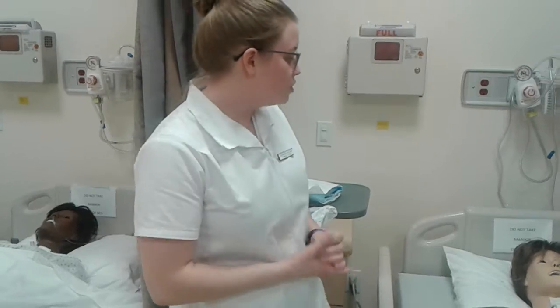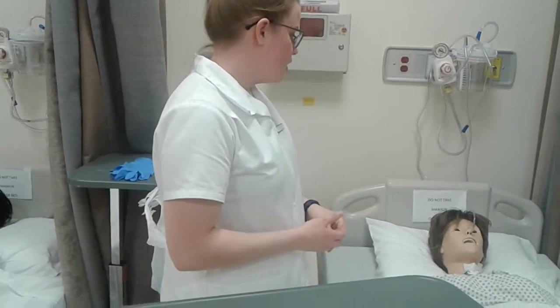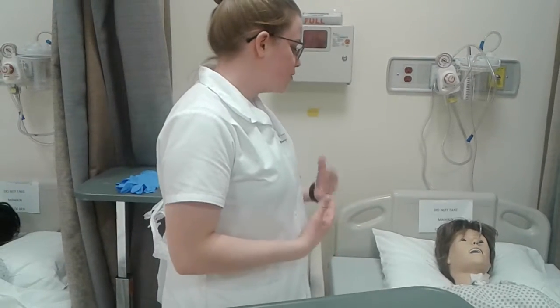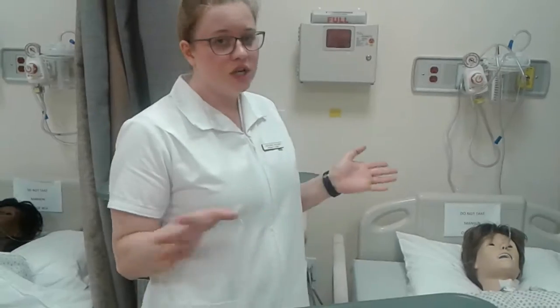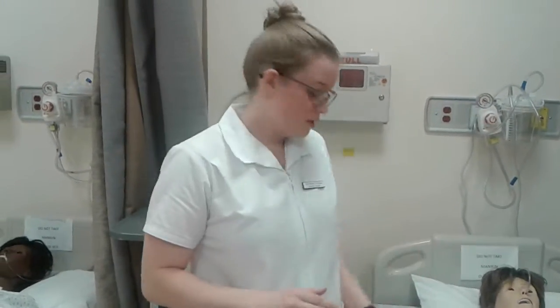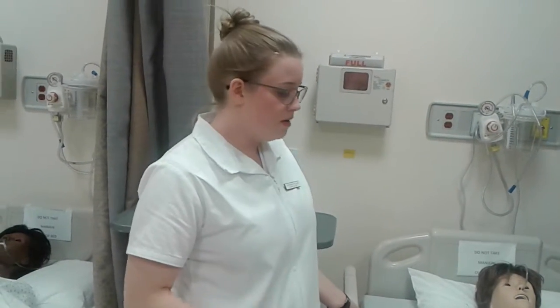I would start by assessing her comfort level. I would explain that I'm going to be changing her central line dressing, and I would instruct her not to touch any of my sterile equipment or the central line site throughout the procedure. This helps to maintain sterility. Now I'm going to raise the bed and place her into a low Fowler's position.